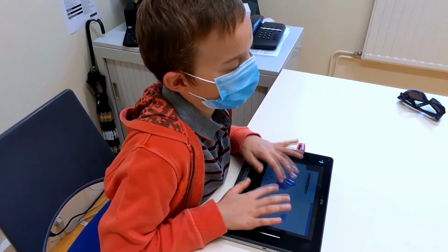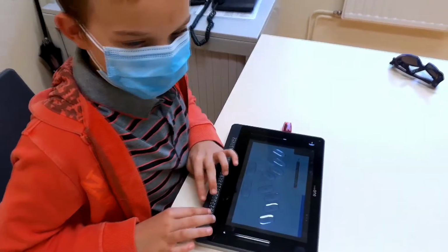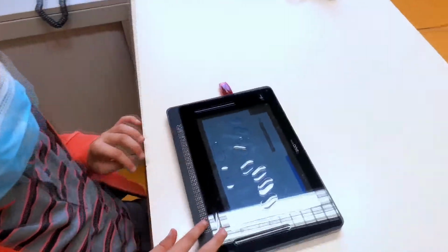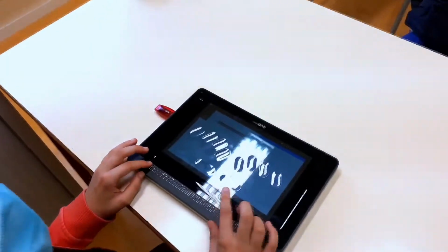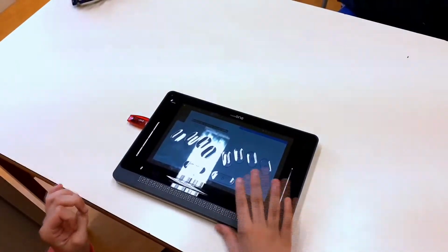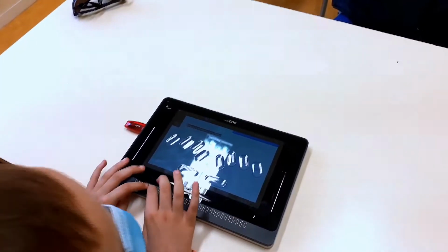So how do you read then? Me? I read in Braille with the small raised pins. If there are no raised dots, say it is a space, the blinking dot going up and down represents the cursor. And how do you read here on this PC, for instance? Me? I read with my fingers.